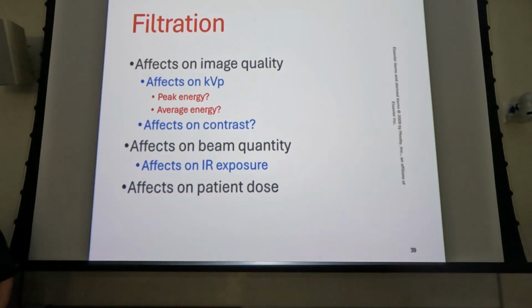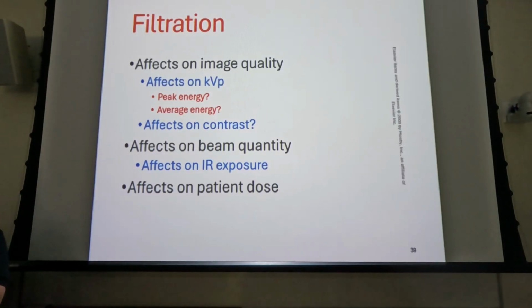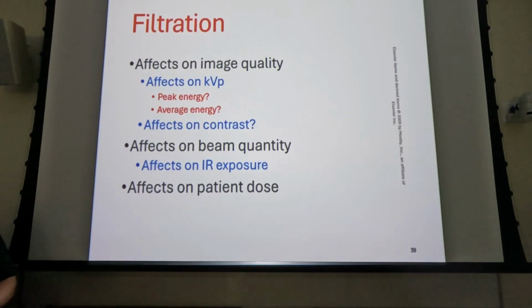What you'll see and hear the beam referred to as, as average or kVp goes up, is that it's a harder beam, okay? So it's a higher quality beam. kVp controls your quality, so even in the entire spectrum, if our kVp doesn't go up but our average increases, we still have a better quality X-ray beam, more likely to penetrate. Penetration equals quality. So it will affect our quality. It doesn't affect our peak energy, it does increase our average, really no effect on contrast. The quantity does go down though.